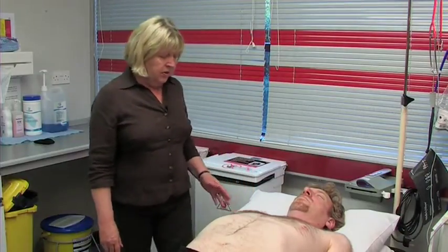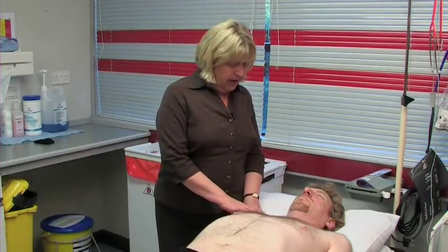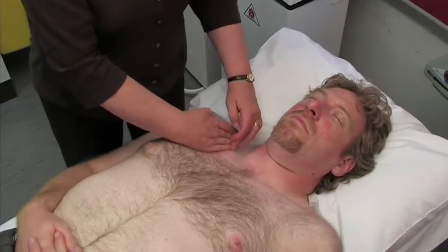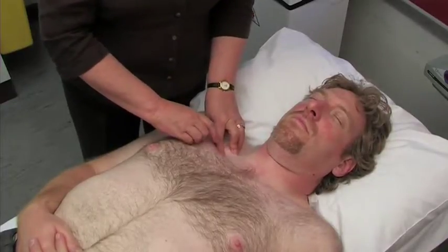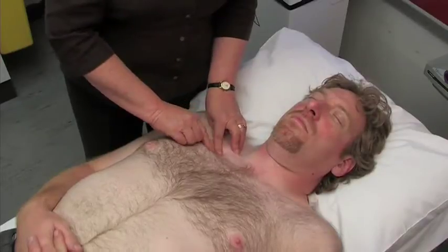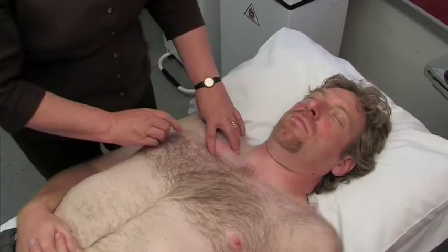We need to look for the second intercostal space, halfway along the collarbone — from here to here, that's roughly halfway. Immediately below the collarbone is the first rib space. You will then feel the second rib, and you want to go into the space below the second rib.